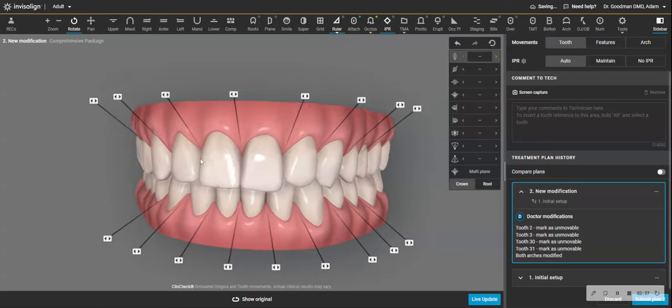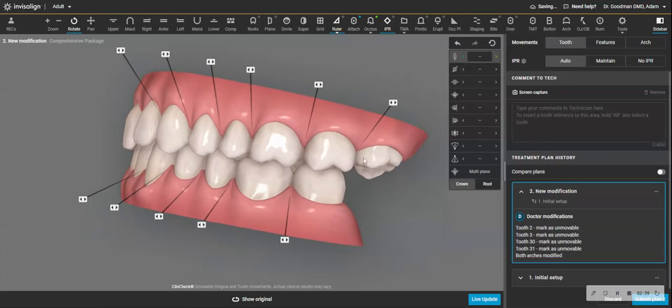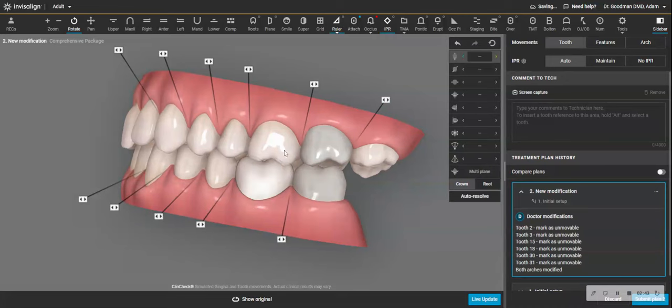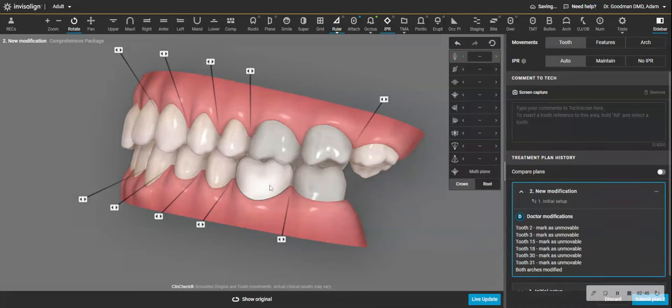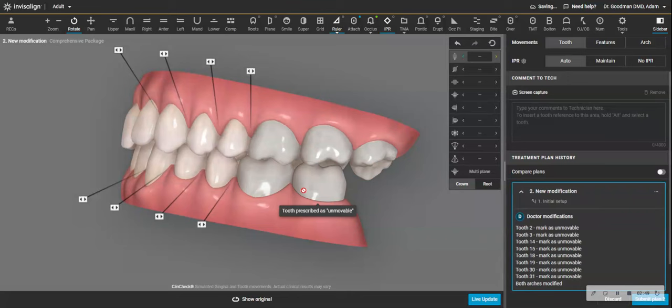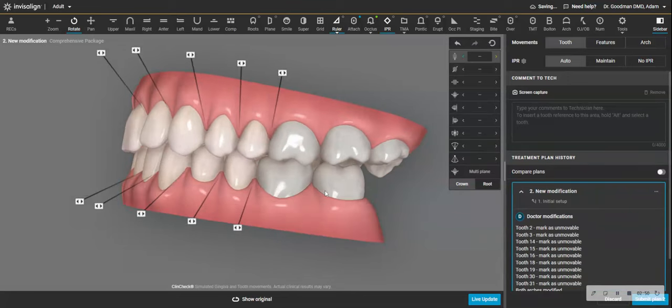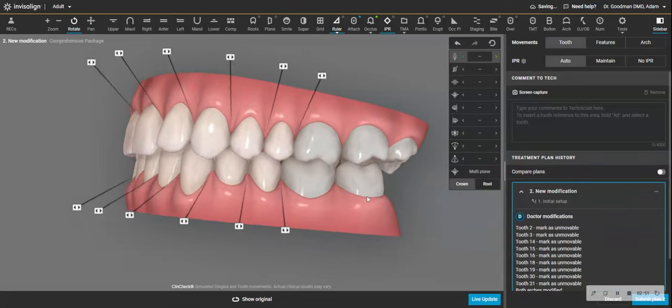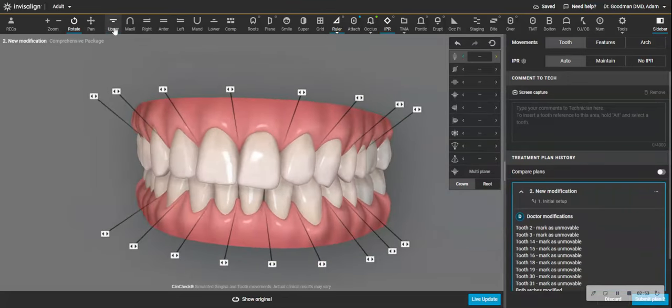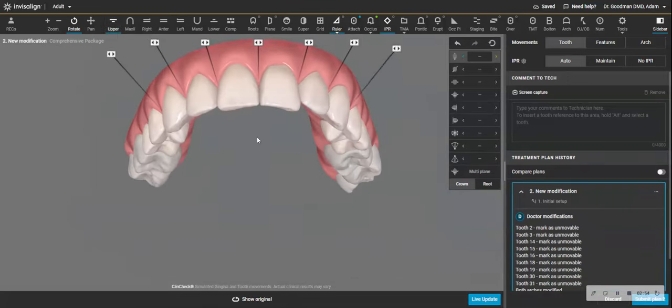Now, of course, if this is a patient who is uncomfortable with their bite or has a very tipped molar that needs uprighting, well, that's what the point of the treatment is and you need the uprighting. So I'm just going to program this to keep everything as it has been. Now I'm going to look at the ClinCheck.